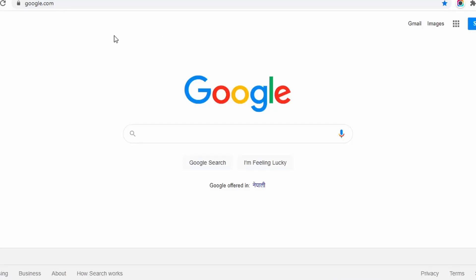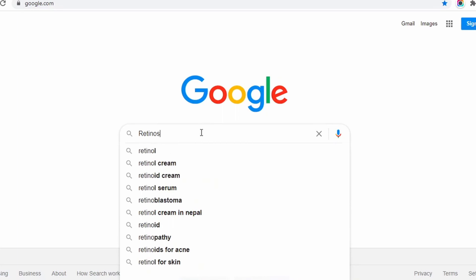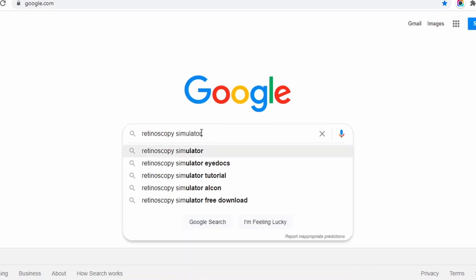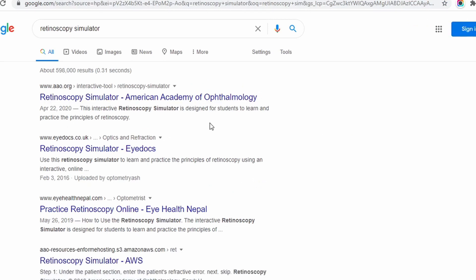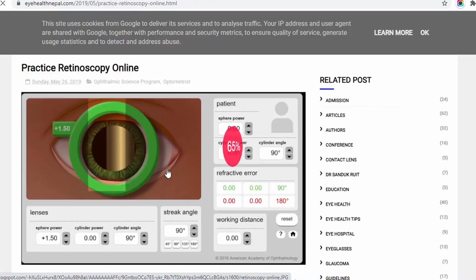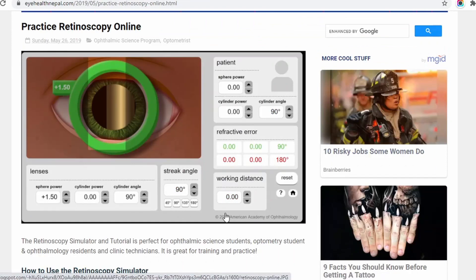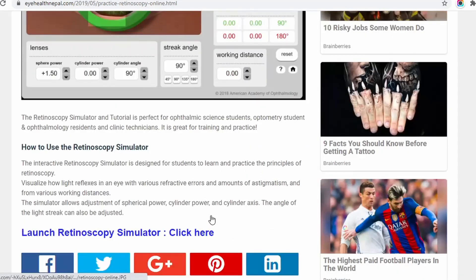First, go to Google — you can type google.com and search for the retinoscopy simulator. Here you will see the retinoscopy simulator by the American Academy of Ophthalmology, one from iDoc.co.uk, and another one is practice retinoscopy online by iHealth. You can go to iHealth, and this page will load. You can also directly go to the American Academy of Ophthalmology web page, or click the link here to launch the retinoscopy simulator, and the page will load.